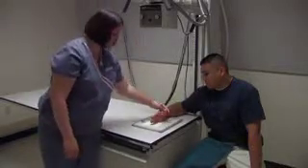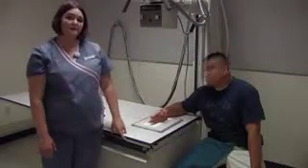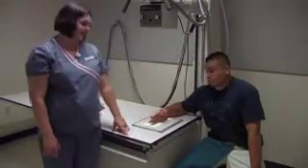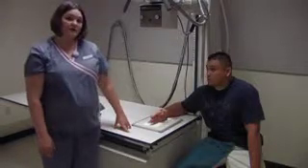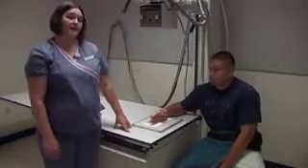Go ahead and bring your thumb in for me, please. Make sure your marker is in the light on the lateral side. And this is a lateral projection. So again, you would have a PA, oblique, and lateral projections for a hand examination.